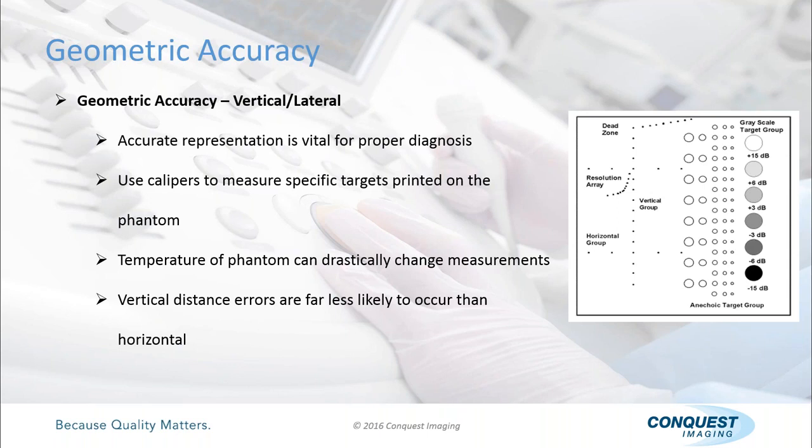And obviously on this picture on the right, there is no measurement information on it, but on your actual 539 Phantom, there will be very specific places where you can measure to see if your calipers are measuring accurately. So you need to find these different places on your Phantoms and do the measurements and get hard copy printouts so that you can confirm that the system's working correctly. Now, you don't need to do this with every probe per se, but you definitely want to have a good set of printouts that illustrate that your calipers are working accurately.